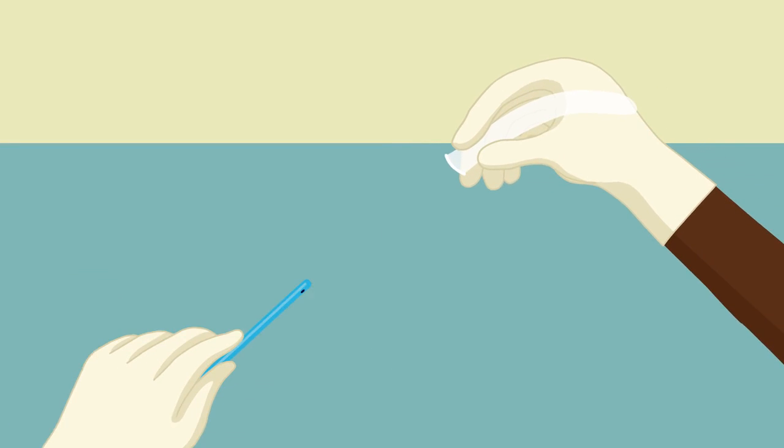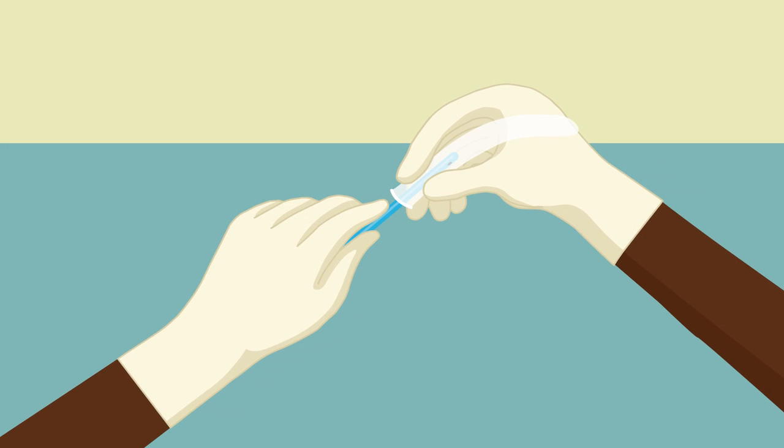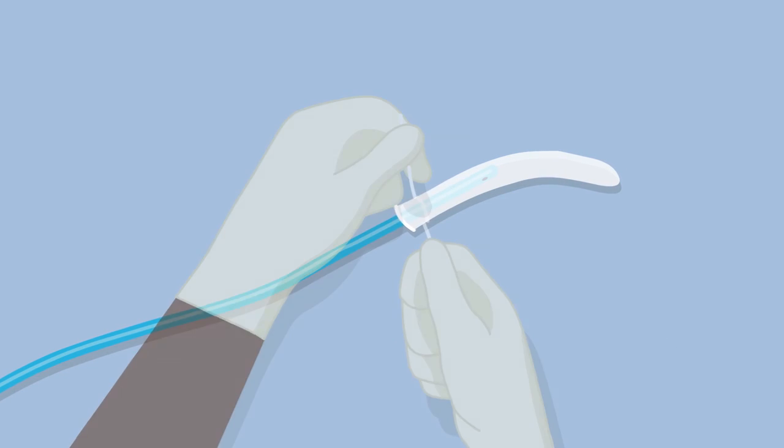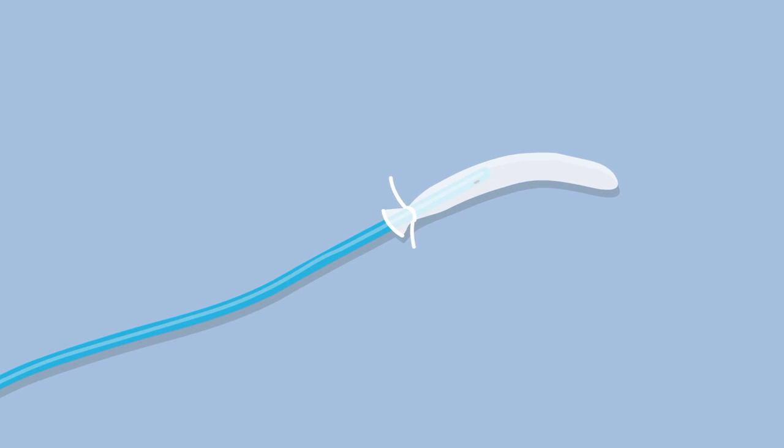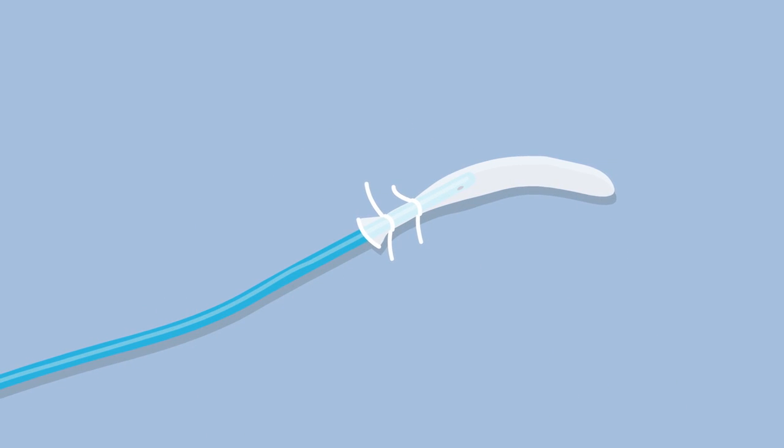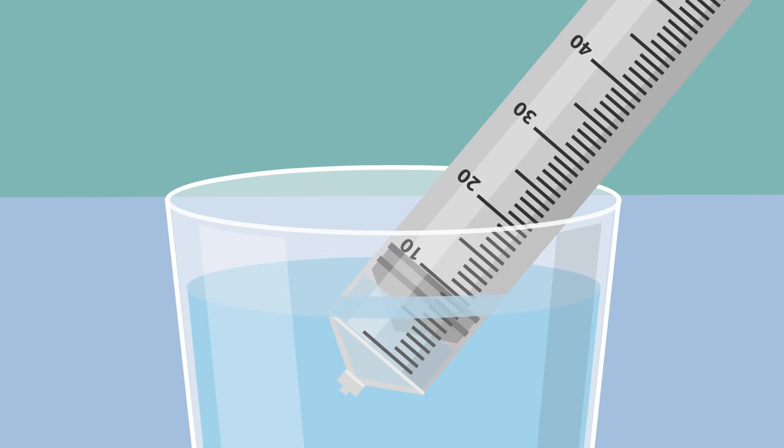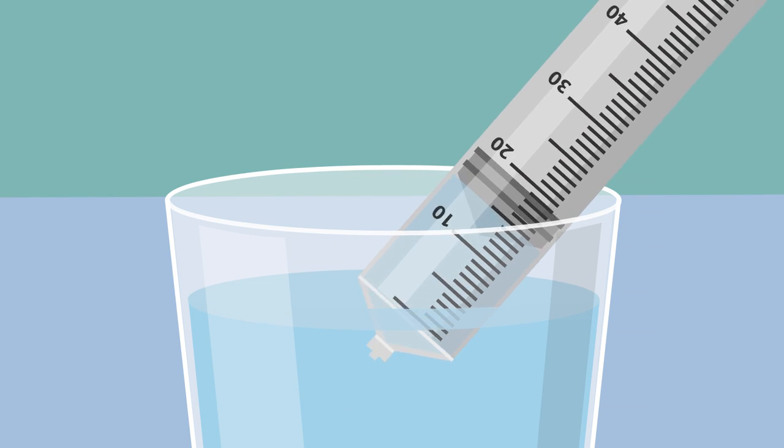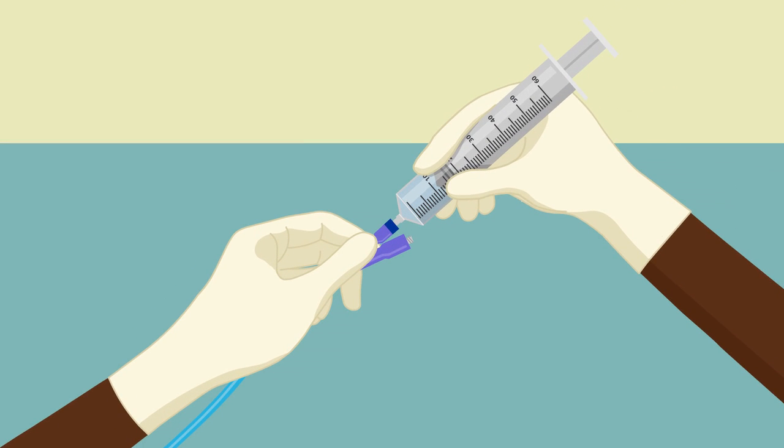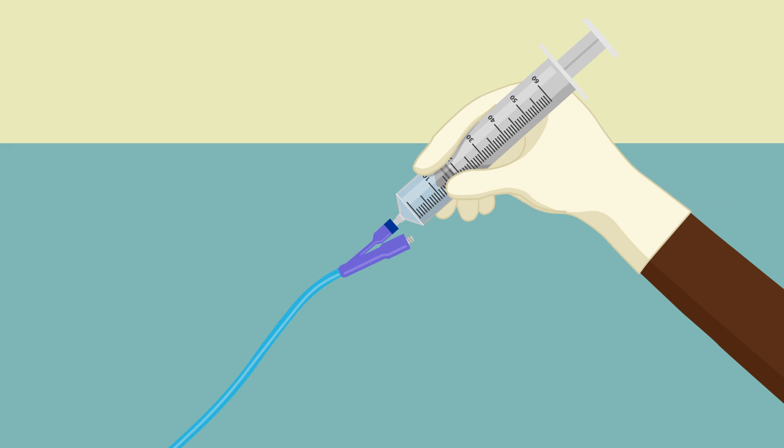She inserts the catheter halfway into the condom balloon. She carefully wraps both pieces of string around the base of the balloon, tying it tightly to the catheter making sure it will not come loose. She draws clean water into the syringe and attaches it to the catheter at the opening used to fill the smaller Foley balloon which is at the top of the catheter.